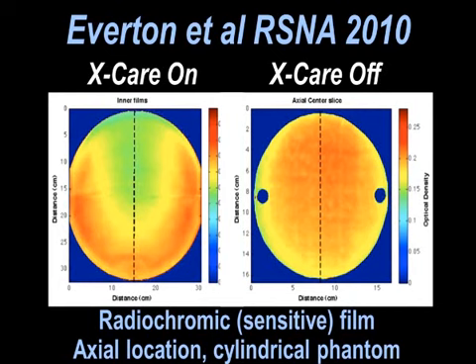But one thing you'll notice is, look at back here. This is now pretty red back here. So what you gain by turning it off anteriorly is, to some degree, made up by scanning posteriorly. You may reduce the breast dose, but the bone marrow dose, the esophageal dose, the posterior dose is going to go up because we're maintaining photon flux here. So understand that it is a technology that has some benefit, but it does have some potential costs too.